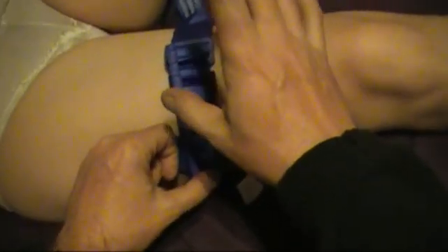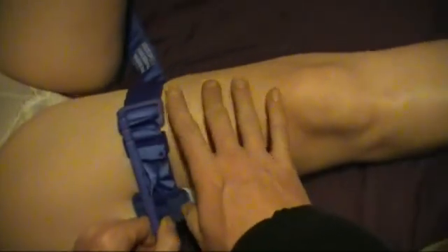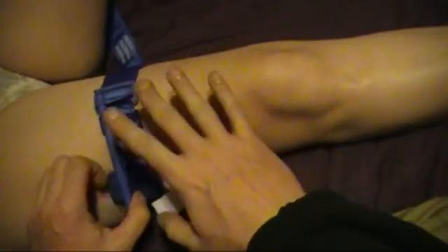Be careful with the CAT tourniquets. First generation CAT tourniquets had a problem of the windlass actually snapping. That's how much pressure you're going to be applying to occlude the bleeding. Another thing you can do is check for a distal pulse further down from your wound site, and see if there's a pulse going on. No pulse, good to go. But don't worry about that. Don't overdo it. No more bleeding, no more tightening.